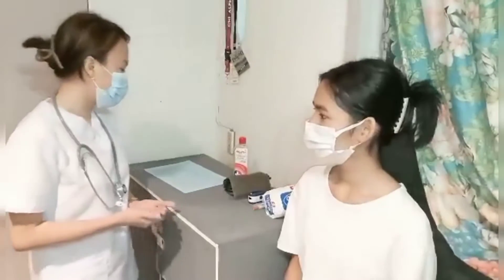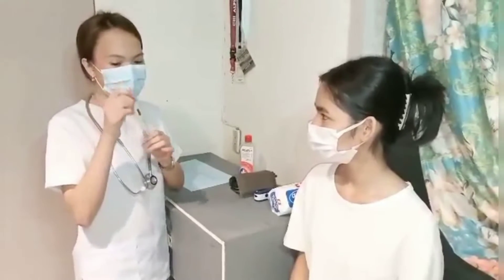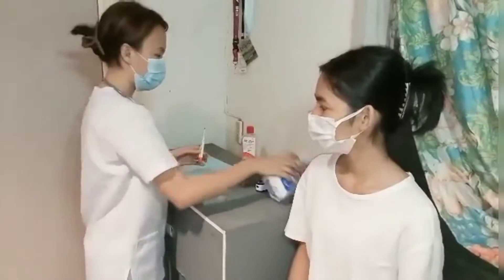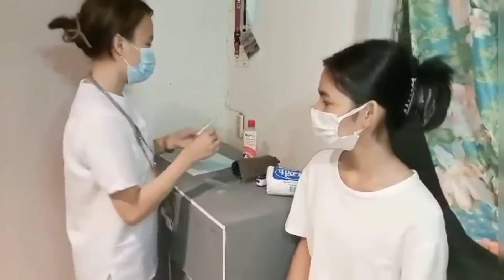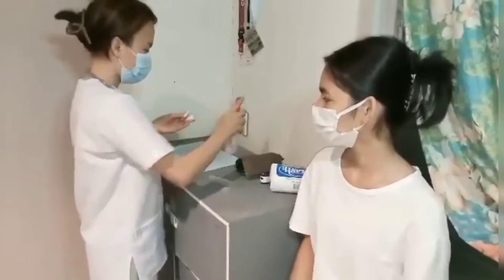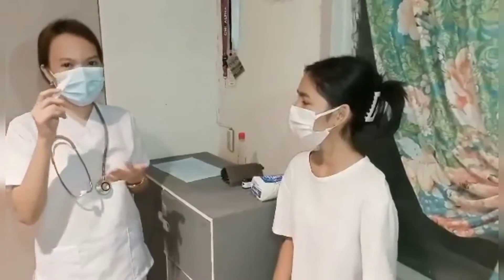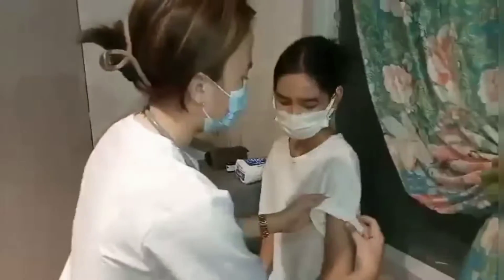First, we're going to take your body temperature, so I'm going to get the digital thermometer. Prior to doing the procedure, we must first disinfect it. I'm going to insert the digital thermometer on her armpit, so first I'm going to roll up her sleeves.